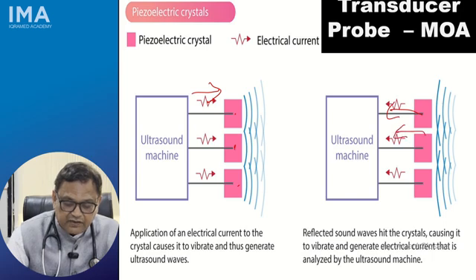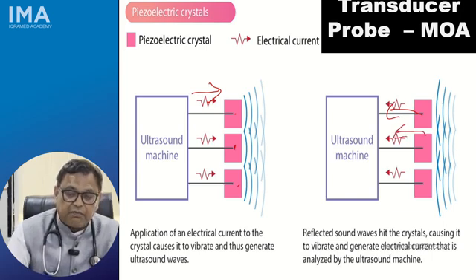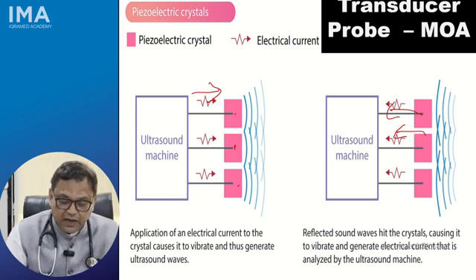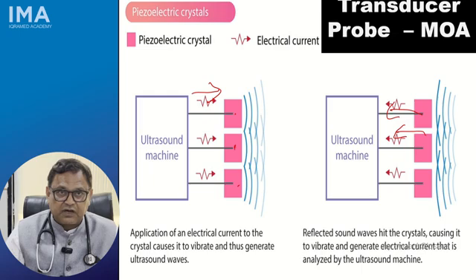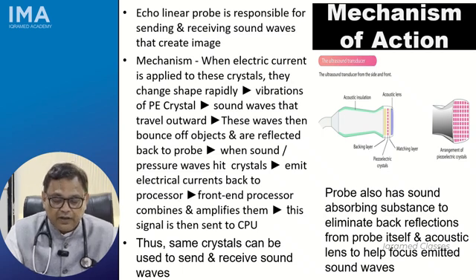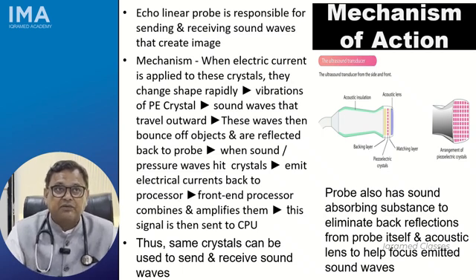So the sound wave gets reflected back, again picked up by the probe, which is the part of the ultrasound machine, and then the whole process starts. So this is the way this particular thing works. And I already elucidated the mechanism of action.